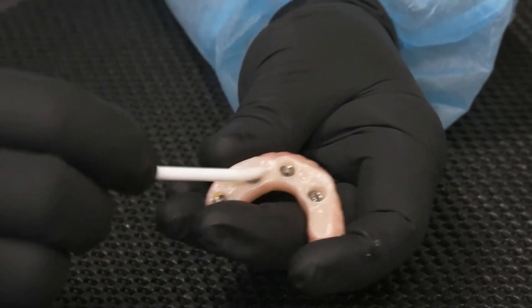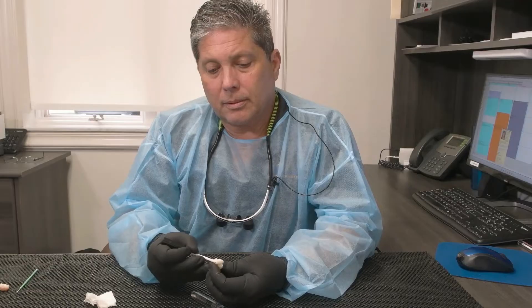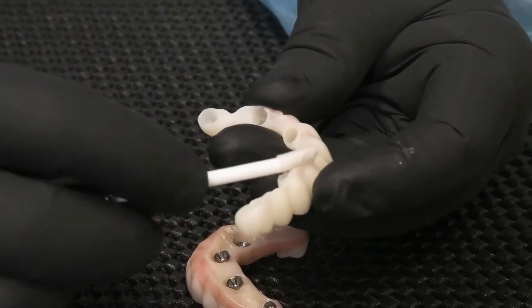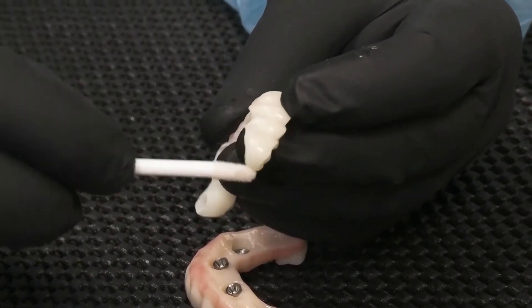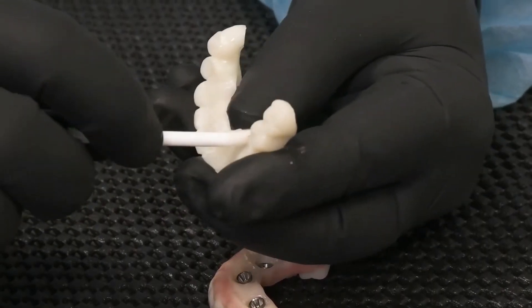Go ahead and cover the whole thing liberally, and especially on these linguals. And the same thing on these. This is a number of implants — it's a cemented case. Apply it liberally on the case, on the lingual especially.